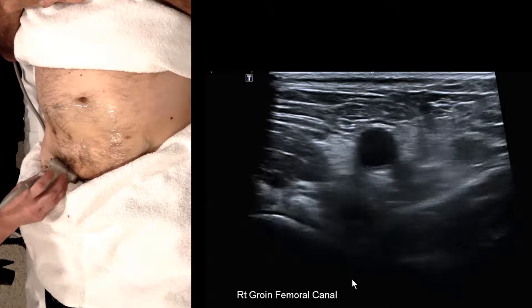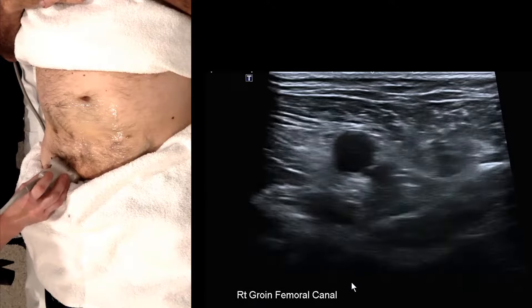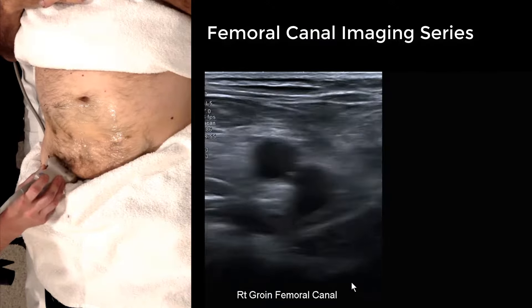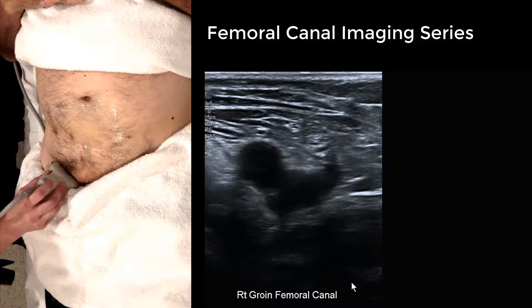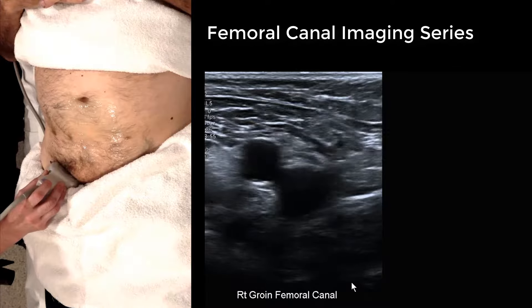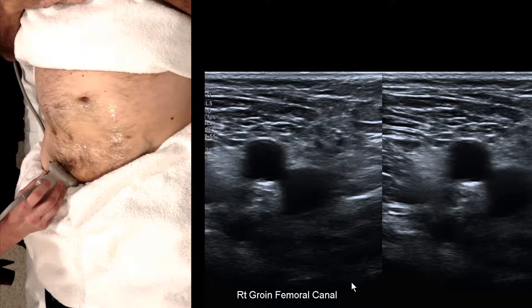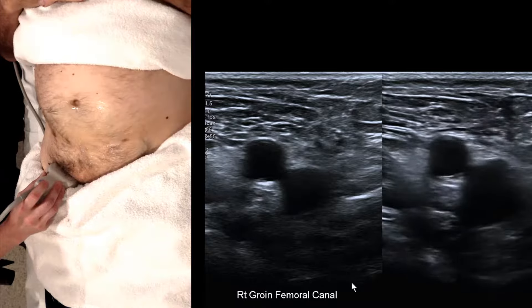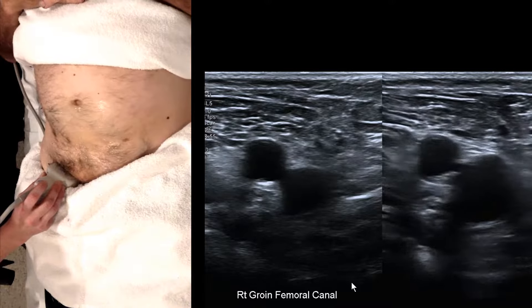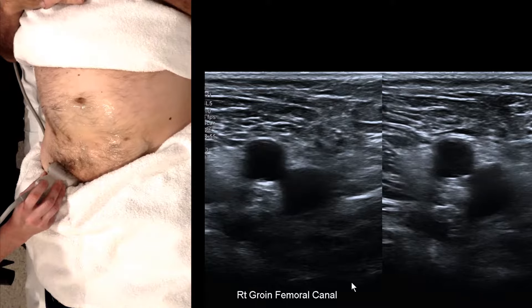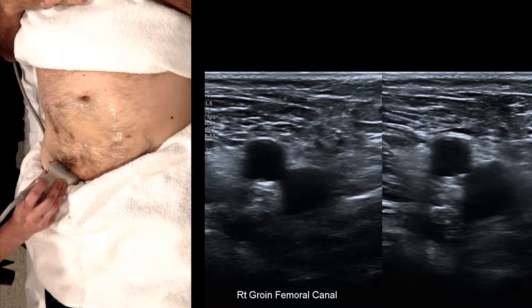Back in transverse, take your imaging series: find the SFJ, move immediately superior, take a dual image and ask the patient to strain, making sure you're imaging medial to the vein. At times a large femoral hernia can compress or obliterate the femoral vein, but this is not necessarily reliable criteria.